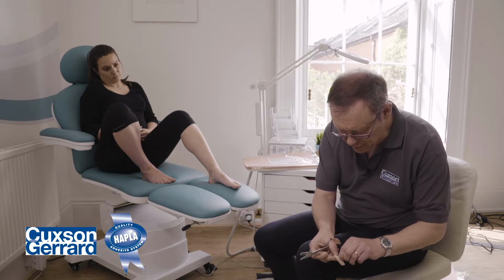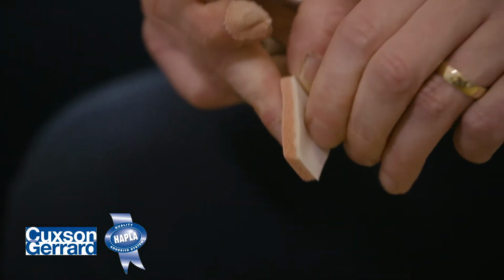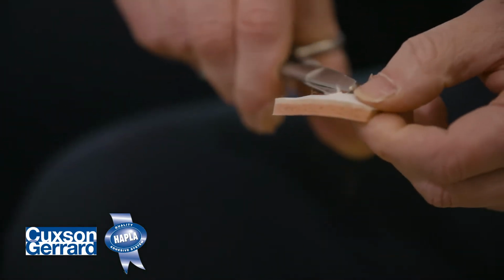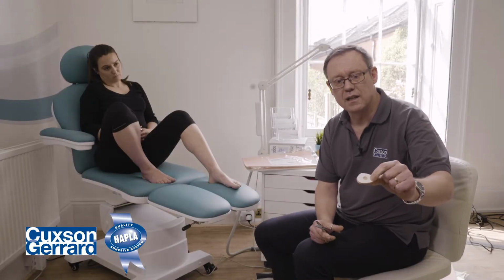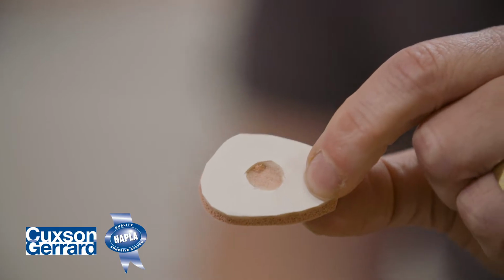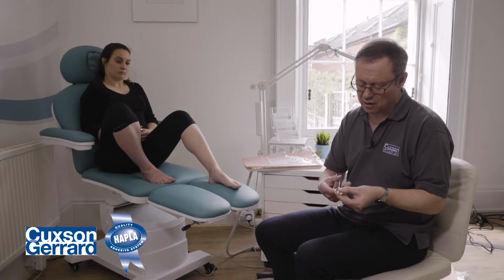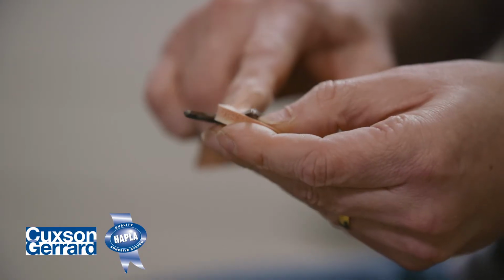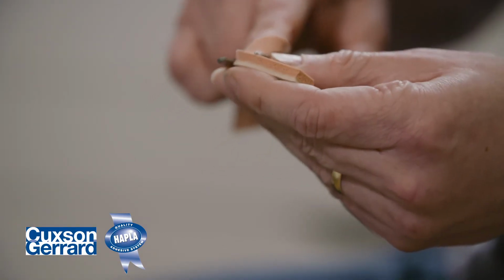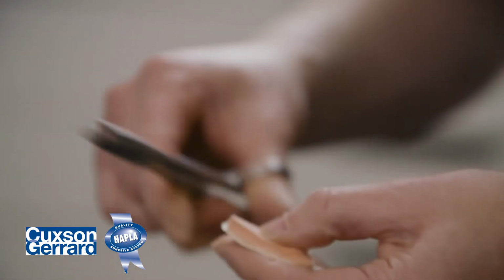And you can just see some wispy pieces of felt, tease them away. And now the foam lid is more apparent underneath. So we've got a 5mm foam lid and a 2mm aperture. Okay, let's bevel round this pad now so it hugs into the lateral and medial aspects of the toe. So just bevel into the foam. Bevel down as far as the felt. Okay, just off at the end as well.